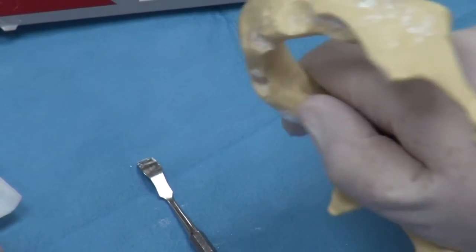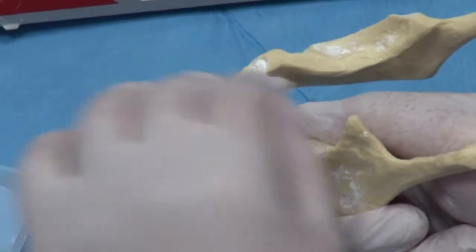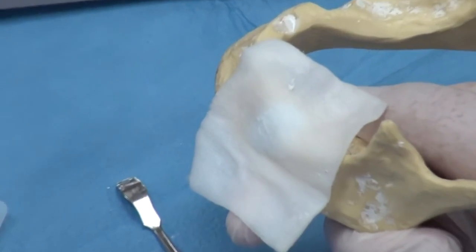To finish, put a wet gauze pad over the graft and have the patient close their mouth passively for two minutes, applying no pressure.